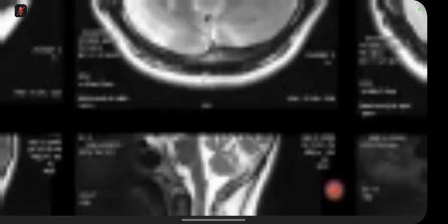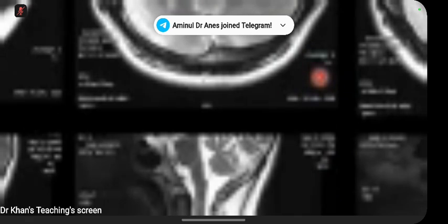Remember this. In this particular case, there are lesions there. So already we have got 2 out of the 5 are there, right? Dissemination space. And then you can ask for contrast. You can ask for rest of the features to diagnose MS.